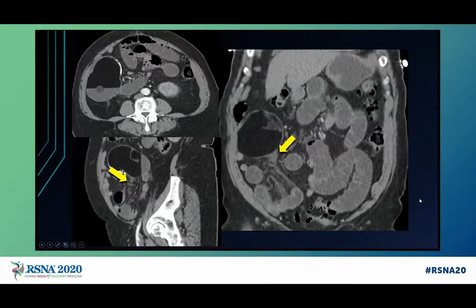This is another patient with small bowel obstruction secondary to a twisting phenomenon in the small bowel mesentery. In this case, the cause was this mass containing fat, fat fluid level, and calcium. This is a teratoma of the small bowel mesentery causing twisting, obstruction, and mild ischemia as noted by this mesenteric edema here, and these were managed operatively.